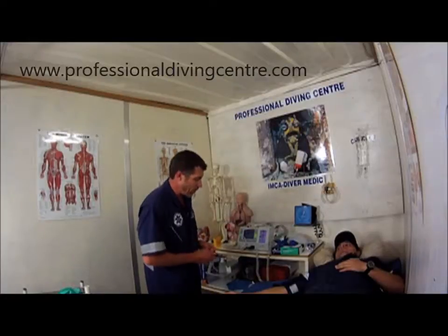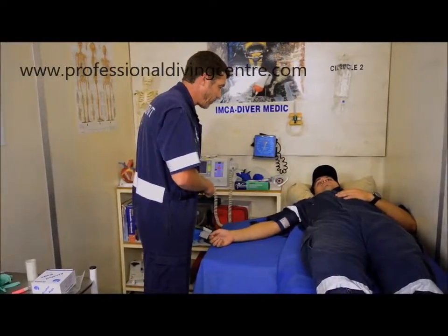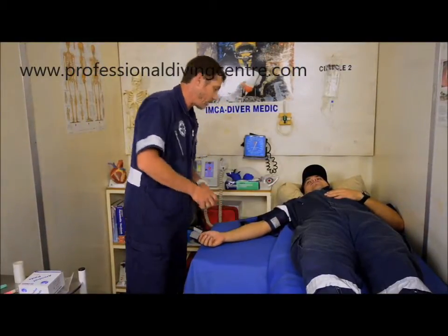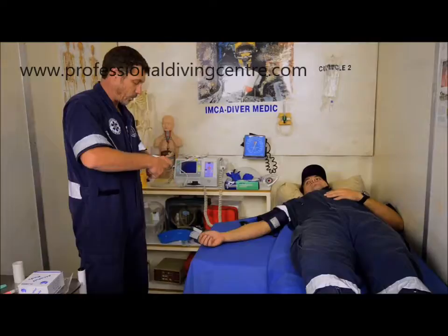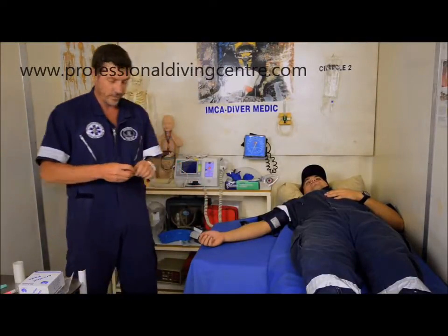Hey Donovan, we're going to be inserting an IV. Are you comfortable? Great. Your arm is good. Position. So when we do this you might just feel a little prick. Shouldn't be painful.